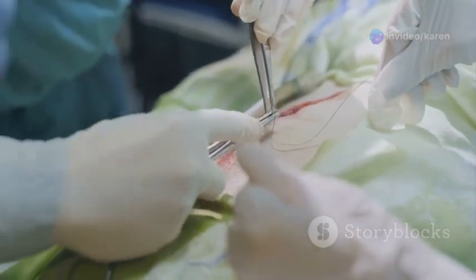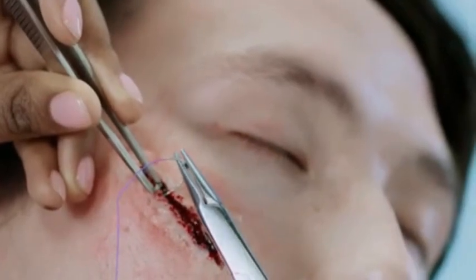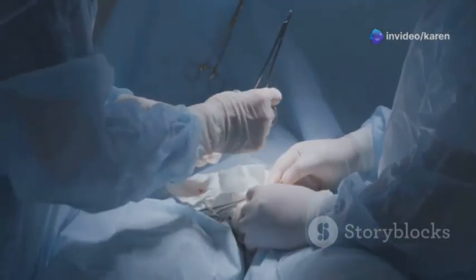Absorbable sutures are commonly used for internal tissues. Non-absorbable sutures are used for external wounds or tissues requiring long-term support. Examples of absorbable sutures include Vicryl and Monocryl. Examples of non-absorbable sutures include nylon and Prolene.